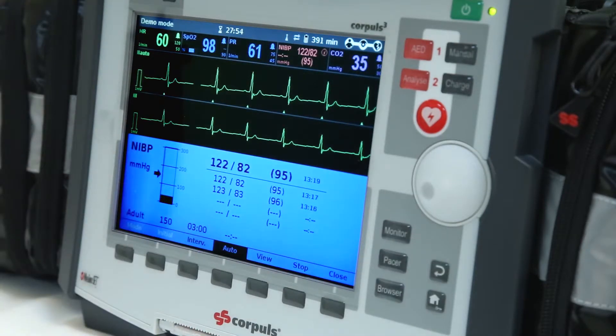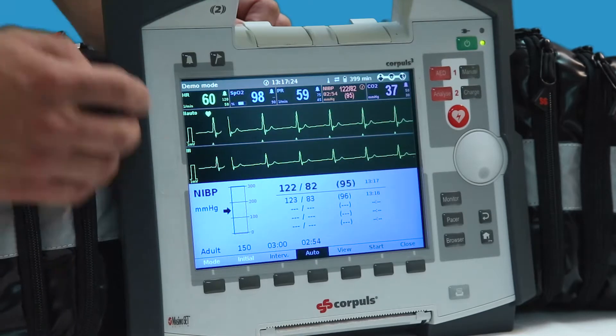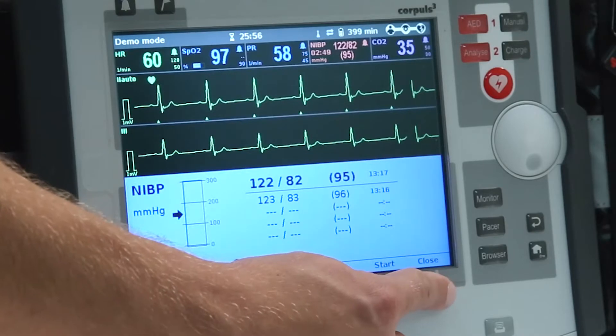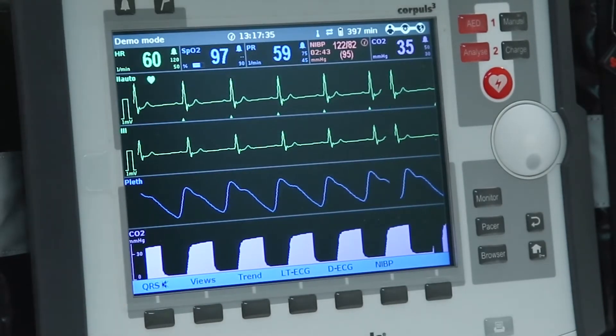To review previously taken NIBP readings, push the view key and the last five measurements will be displayed. The NIBP menu can be closed at any time, and in case automated intervals have been selected, a timer will indicate when the next reading is due along with the latest measurement.